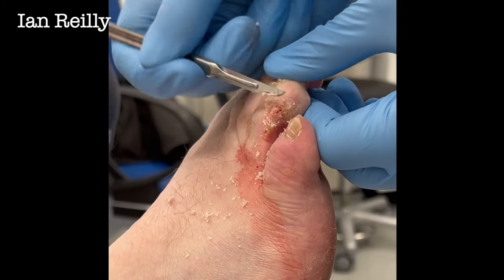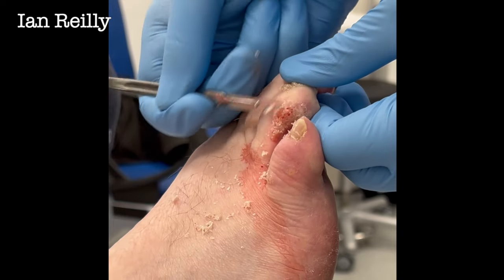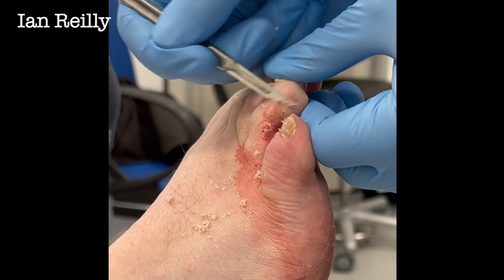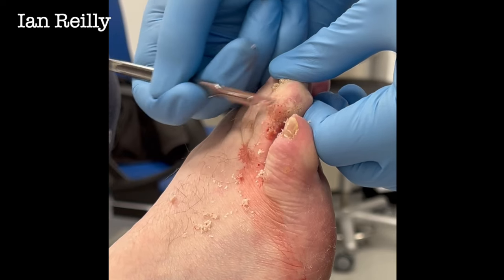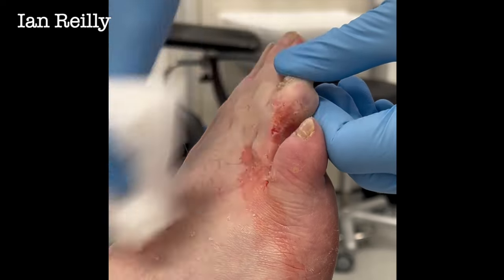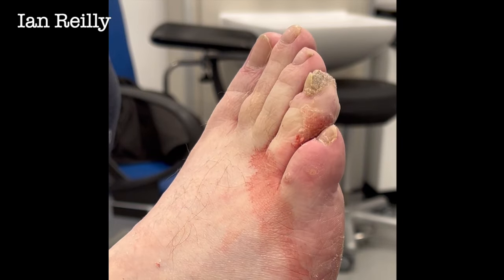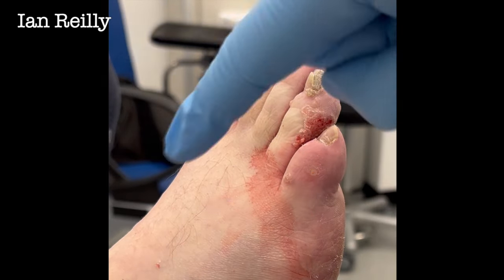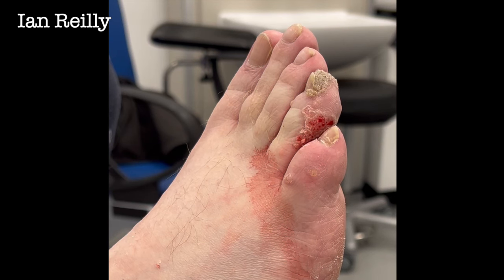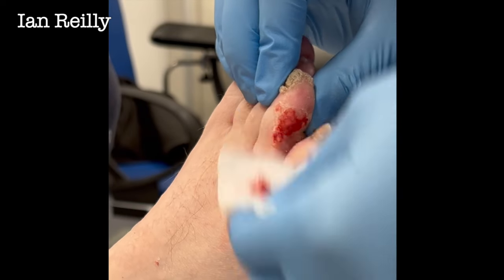Can I get a little bit more chloroprep please? I'm just going to redo the skin. Kevin, the first thing we're going to do is just give it a wee shave. Sorry guys, I just wandered off camera — I'm just going to re-prep that skin.